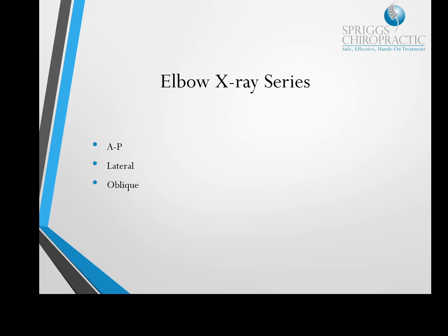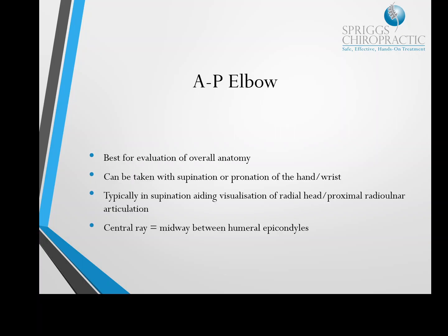It's difficult for the patient to do because most of the time you're going to do an oblique view as a result of a trauma, which usually means that the patient's going to have limited range of motion, and so getting them to do the oblique view can be really challenging, very difficult to do. So take your time, guys, if you're going to set patients up to do this particular view.